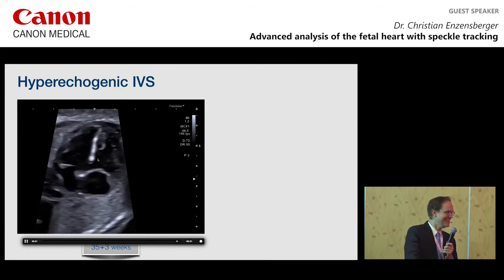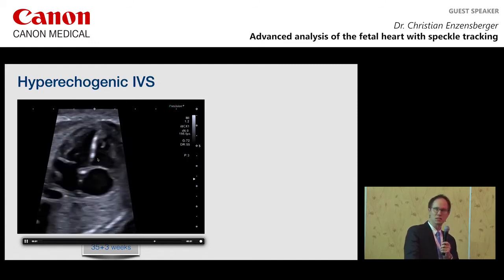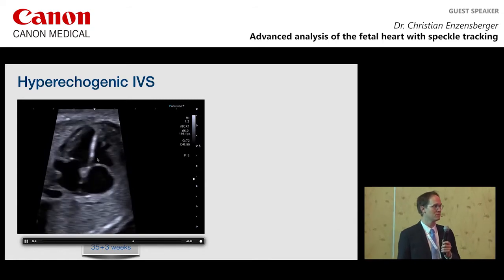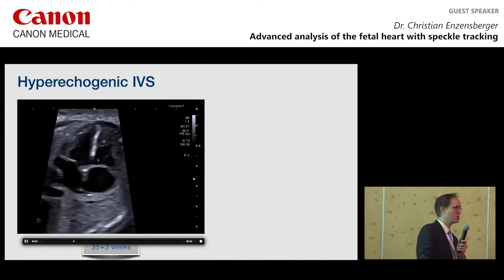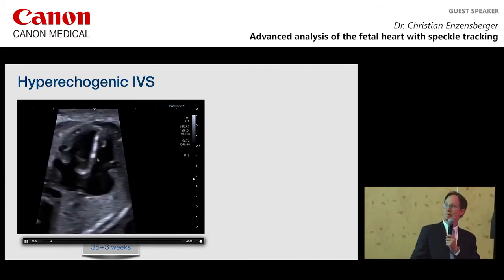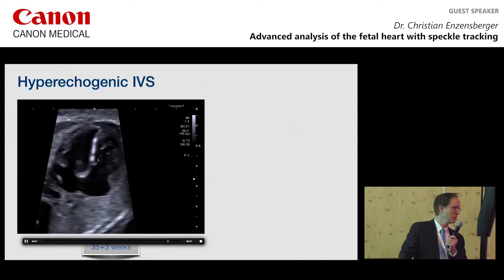Any other comments? Pardon? Brain? For infection. Calcification, yeah, because you have in mind infection. So just morphological, yeah. Completely normal. The TORCH screening was negative.